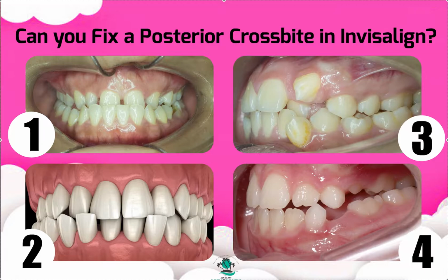I wish they'd almost give it a score, like probability of this happening successfully. That's one of my pet peeves with Invisalign, and I love that they listen to my videos because it is a big problem. If y'all know that your algorithm says this is probably not going to happen, let the doctors know, especially the less experienced doctors, because they really get themselves in a lot of trouble telling a patient, well, hey, the ClinCheck says it's possible, so it must be possible. Well, they don't realize what other side effects can happen when you attempt something that really isn't possible.